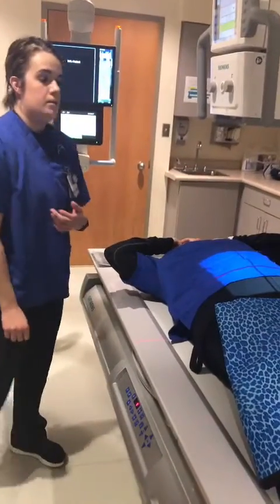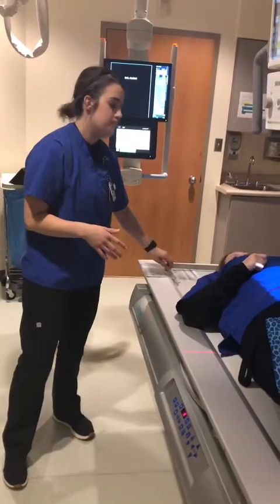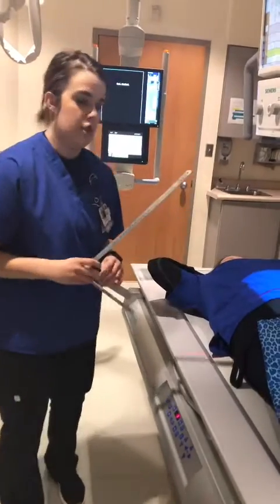Once I am done positioning and I'm ready to make an exposure, I'm going to grab my calipers here, and I'm going to measure the patient, measure the body part that I'm going to be imaging.